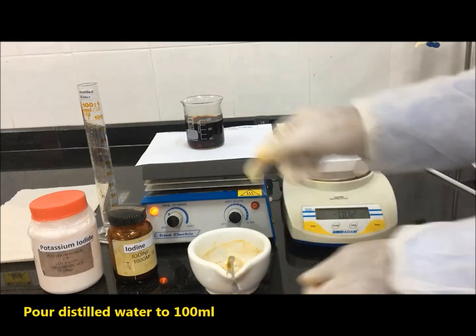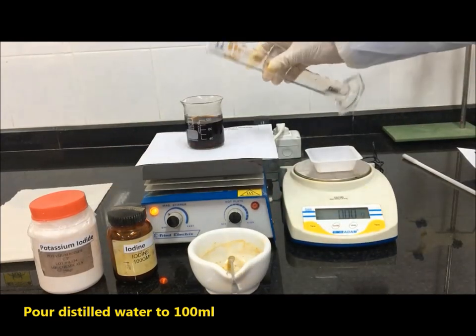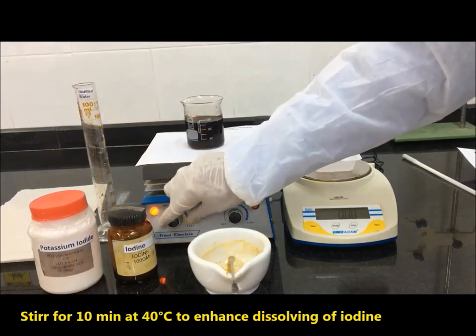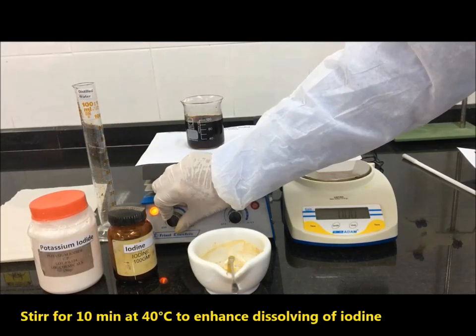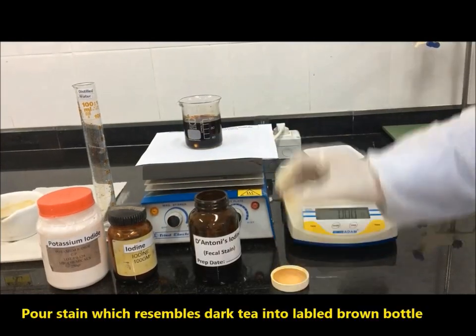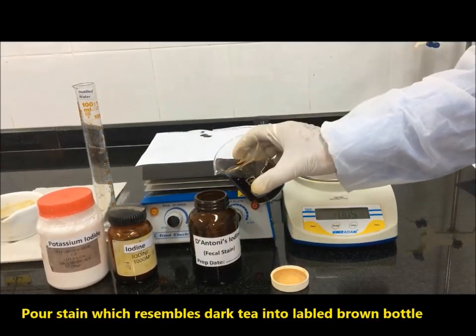Pour distilled water to bring the volume to 100 ml. Stir for 10 minutes at 40 degrees centigrade to enhance dissolving of iodine. Pour the stain, which resembles dark tea, into a labelled brown bottle.